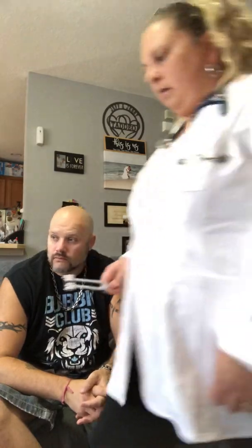Go ahead and do that. So what I want you to do, tell me when you stop hearing the vibration. Now. Can you still hear it? Yeah. All right, good. We'll go ahead and do the same thing on the other side. Tell me when you don't hear the vibration any longer.